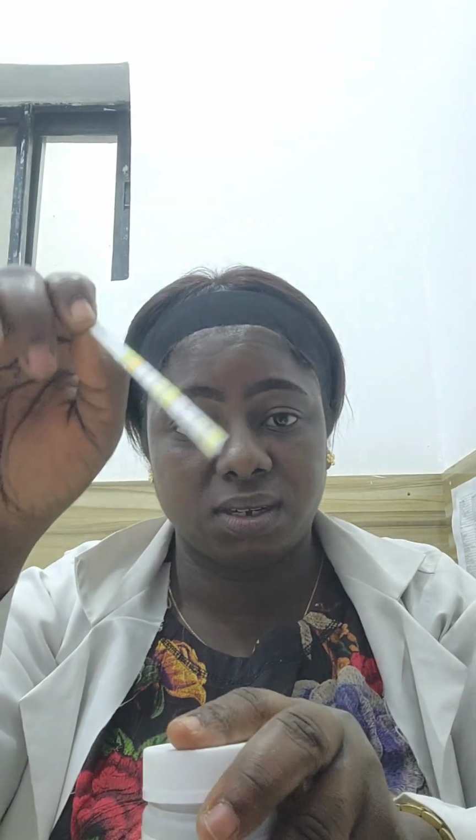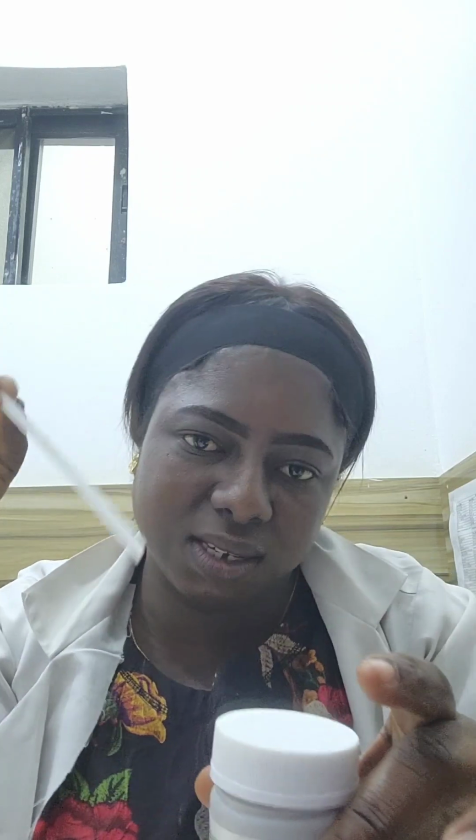Once you dip it into the urine, after waiting for 60 seconds, you use it to read the color, to see the changes. You don't leave it more than 60 seconds or less than 60 seconds, to give accurate results. And you have to try it. You don't open this and leave it in the air.